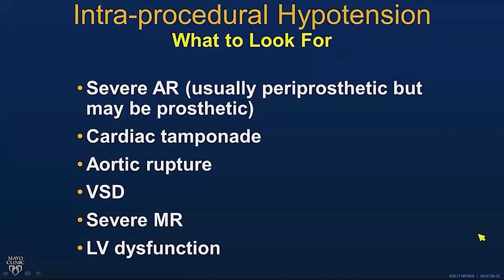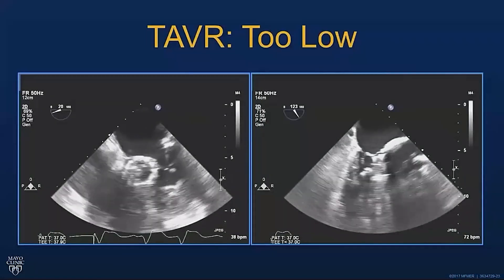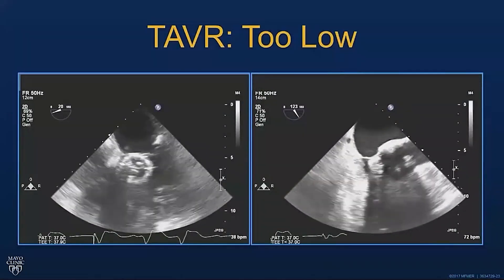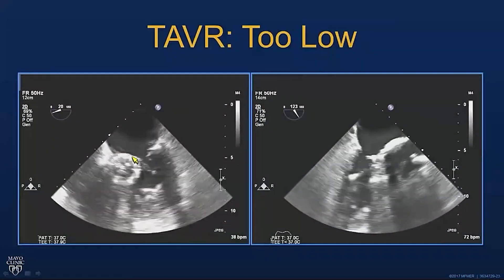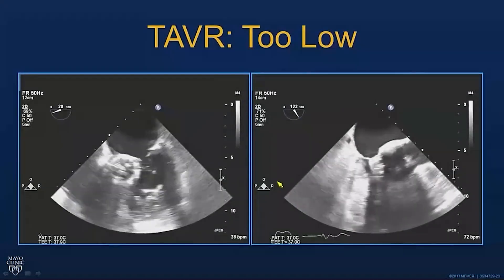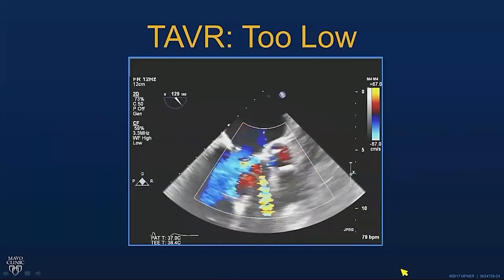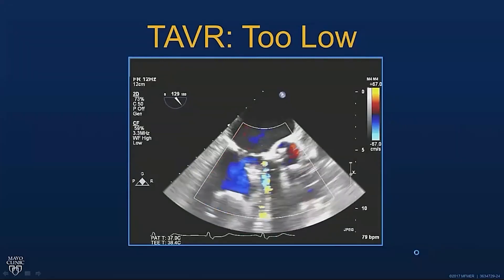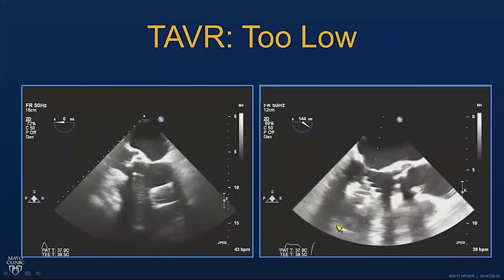If there is procedural hypotension, we look for severe AR, tamponade, aortic annular rupture, a VSD that was caused, new valve disease such as severe MR or TR, or LV dysfunction. Here's an early case where we didn't place the valve in a good position — it's too low. In the long axis view, it's interfering with the mitral apparatus, and there's quite a bit of both prosthetic and periprosthetic regurgitation. The valve is in the ventricle. Fortunately, they were able to retrieve it.